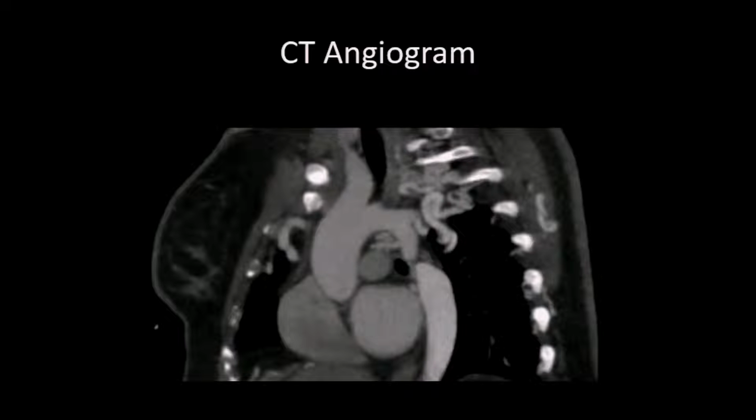You can see here in this patient, this is a patient with a critical coarctation in her 30s who was diagnosed in the setting of a stroke. She had been dealing with refractory hypertension since her 20s on multiple agents, but had not been evaluated for coarctation. And it's important that when you evaluate them with echo, you make sure that your echo is diagnostic, that you had a good view of the aorta and the aortic isthmus. If not, you need congenital imaging if you're trying to rule out coarctation. Cross-sectional imaging, I mean.